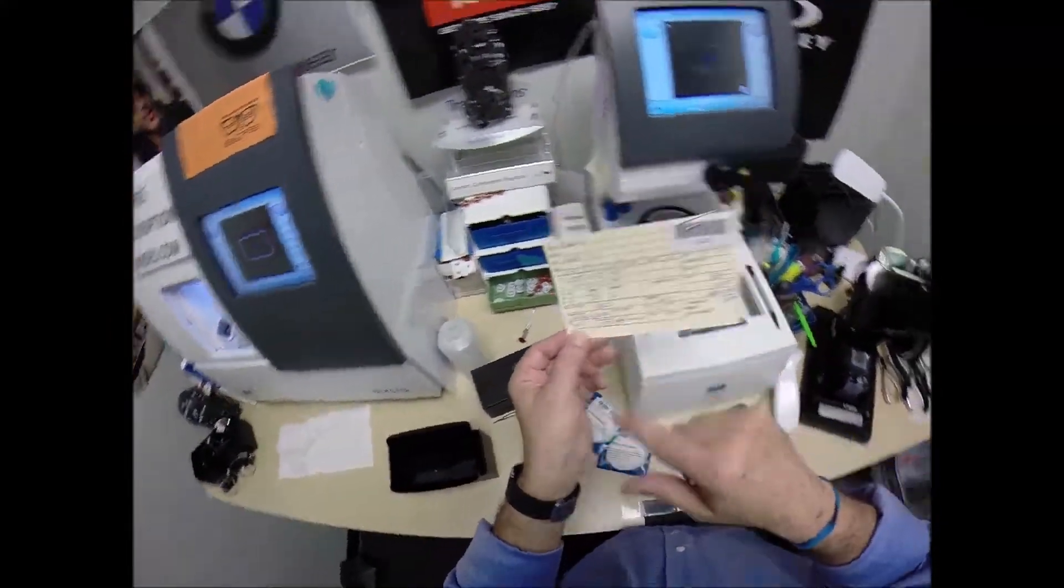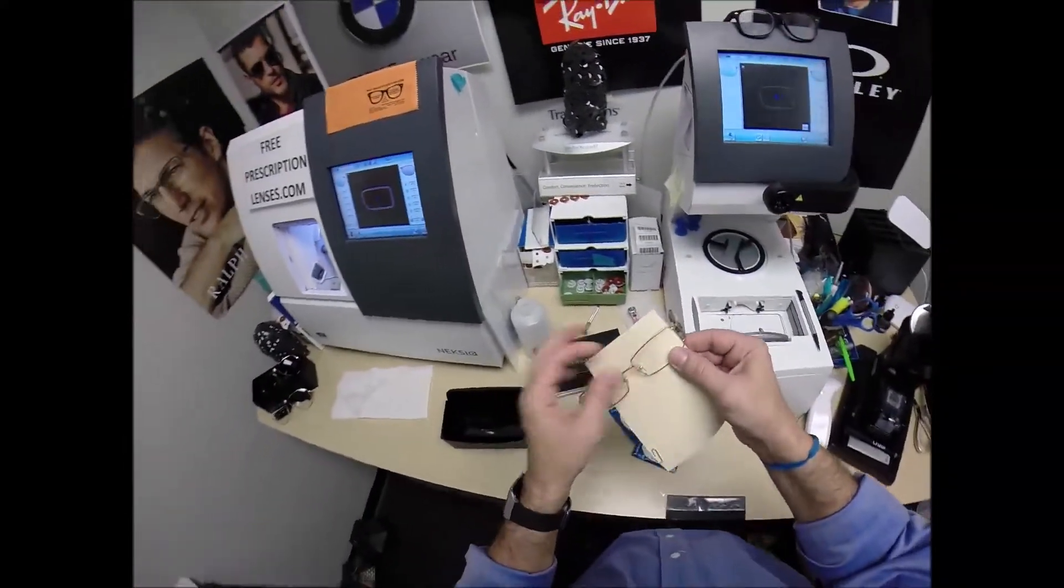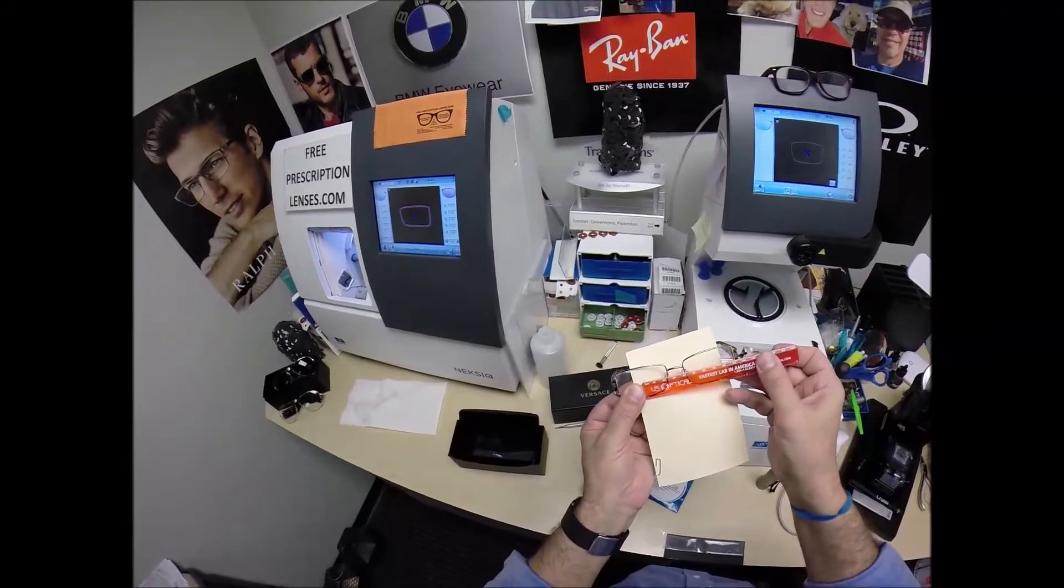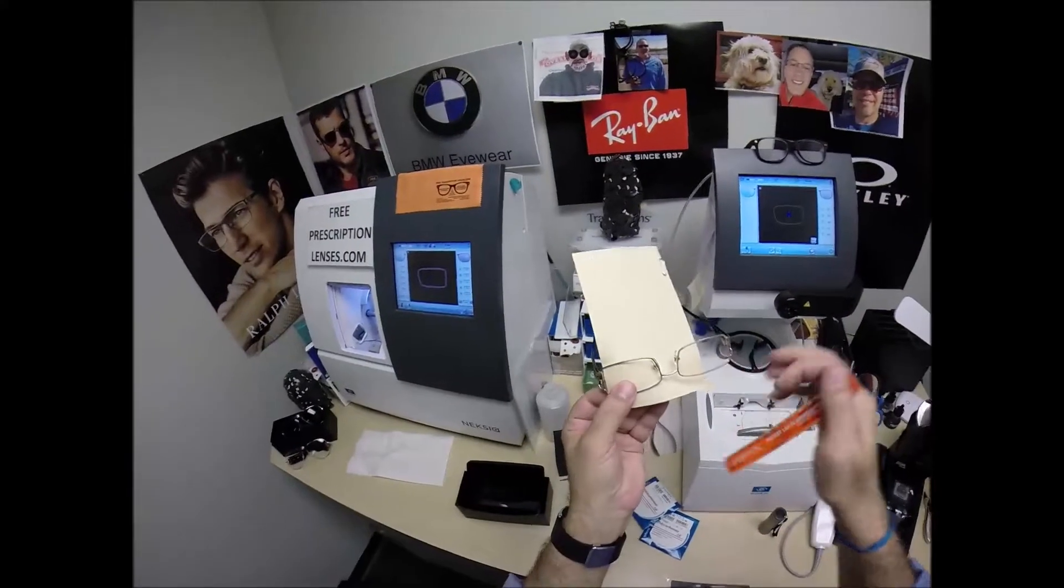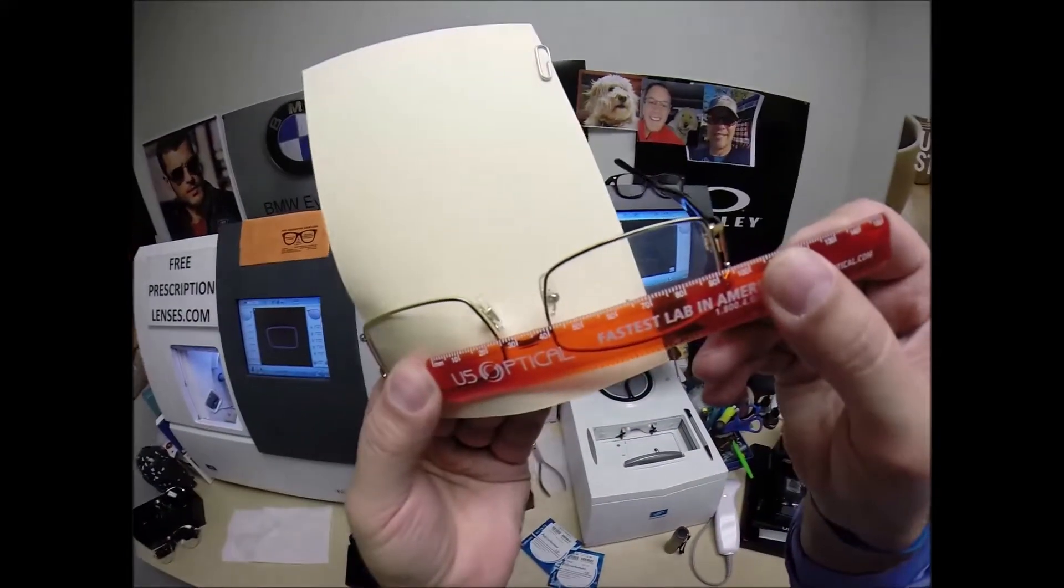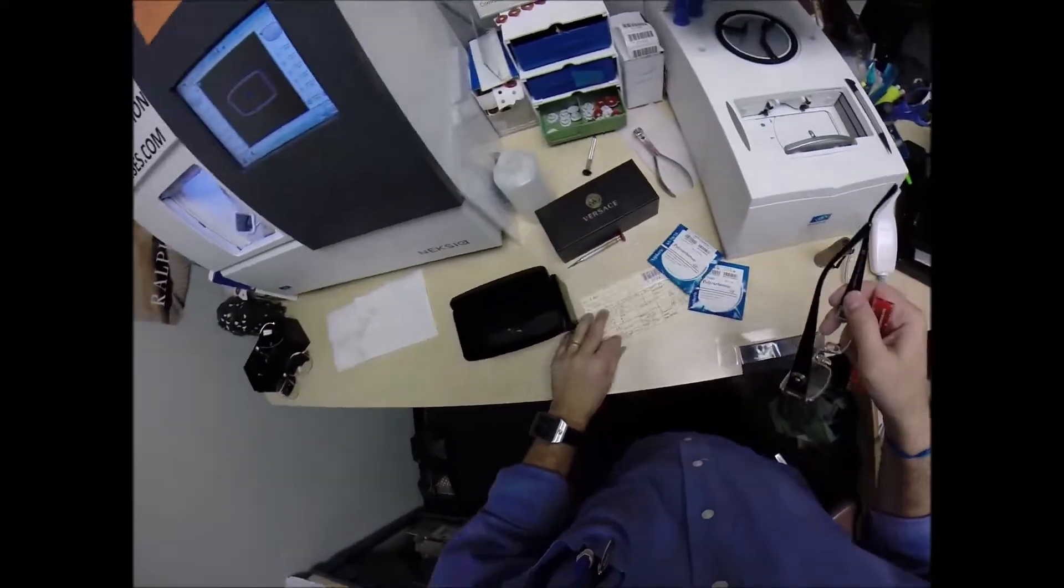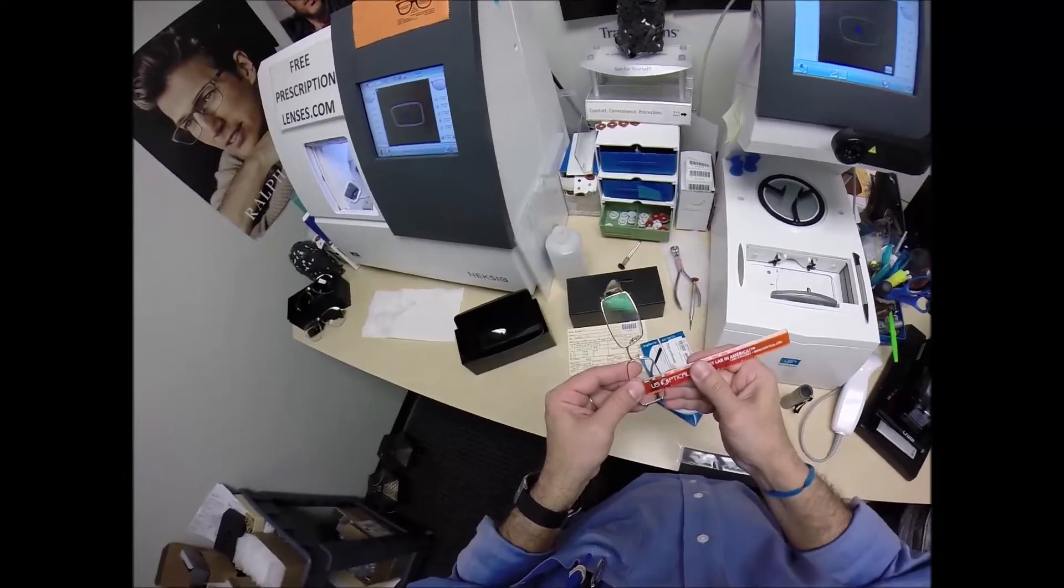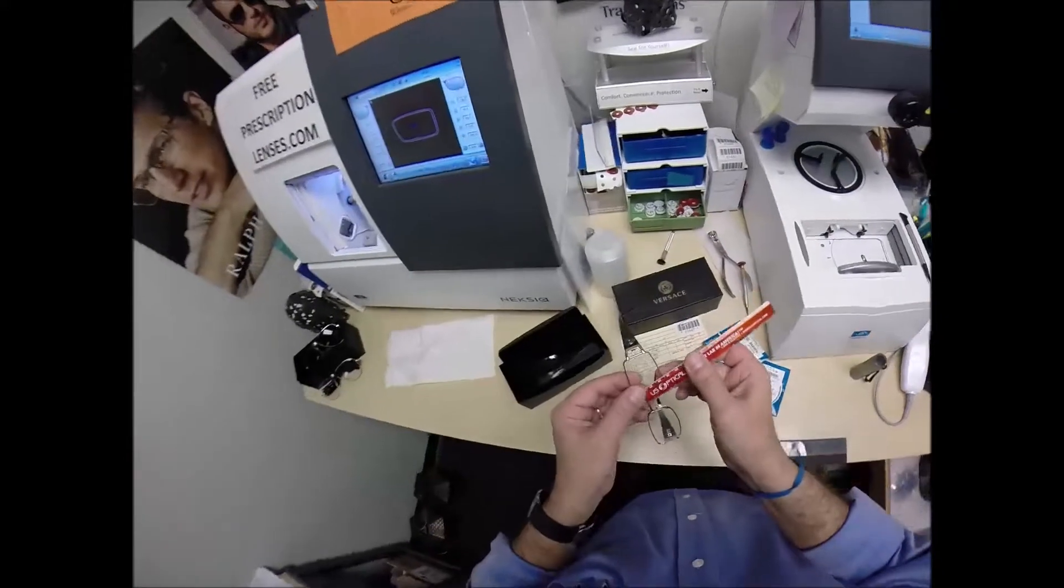Your pupillary distance is 64. I'm going to place the PD stick against my thumb on the right lens. Then we look at it on the left lens. We're getting 64 millimeters. So that is cut perfectly. I'm going to check the optical center height of 18. Two millimeters above the center. We are good. Robert, you are good.